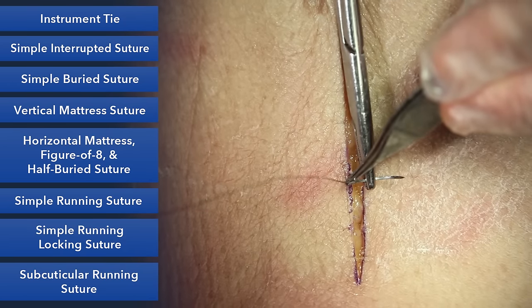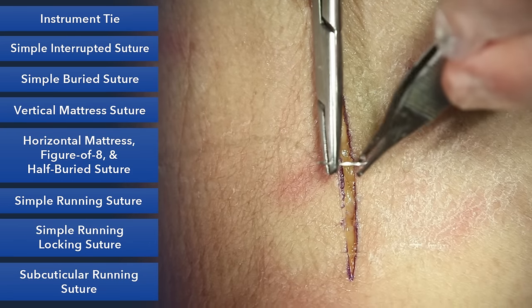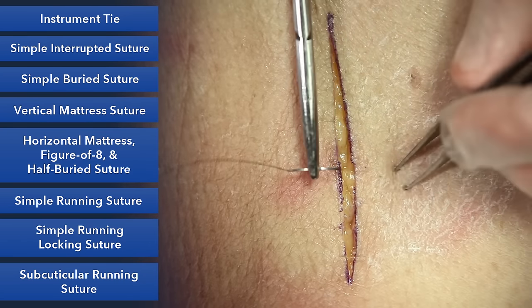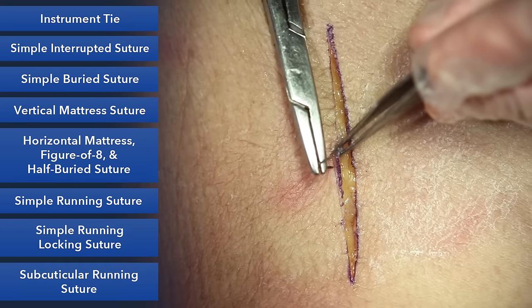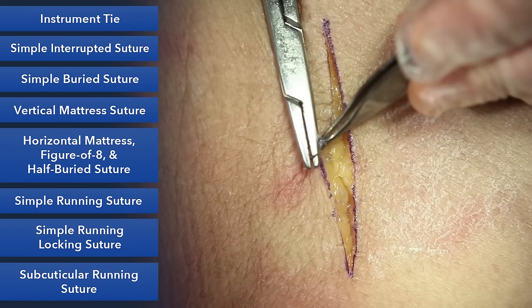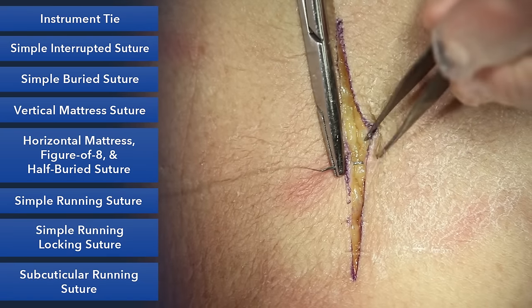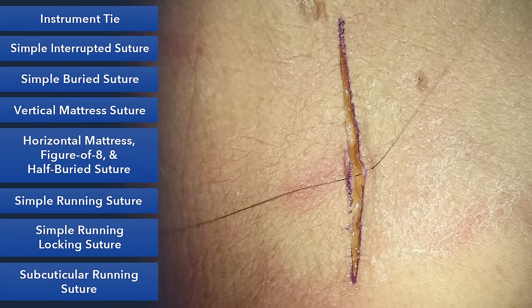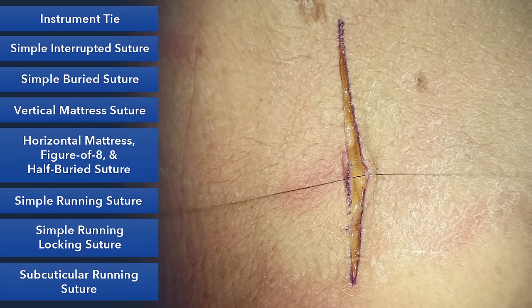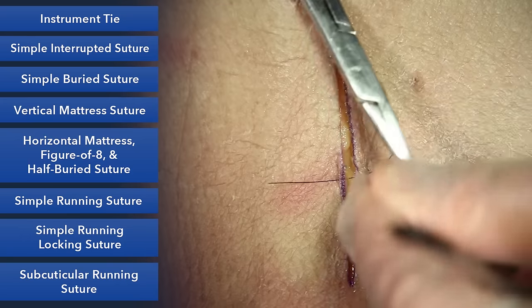You don't want to grab it at the end where the suture comes in, or the swedge, because it's round and you'll be unstable. Never grab the needle at the tip because you'll dull it. A simple bite, we'll want to enter the skin at 90 degrees. And we'll go back a few millimeters from the skin edge and take a nice bite perpendicular to the skin. And then on the opposite side, the same, and exaggerate that 90 degrees. If you take it at 90 degrees, the skin edges will then evert and come together nicely.